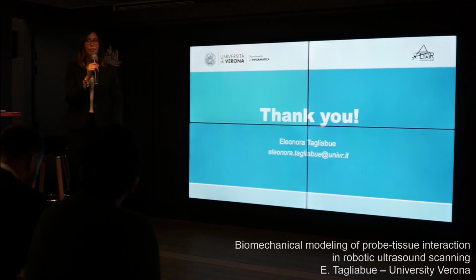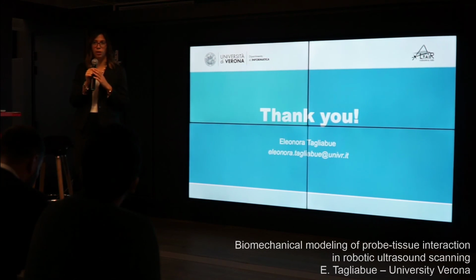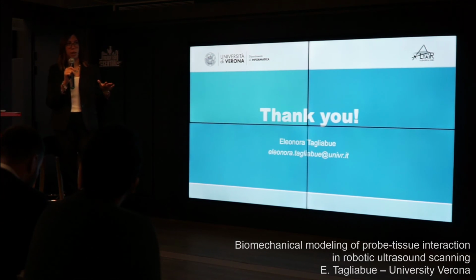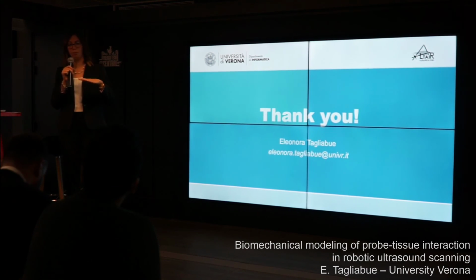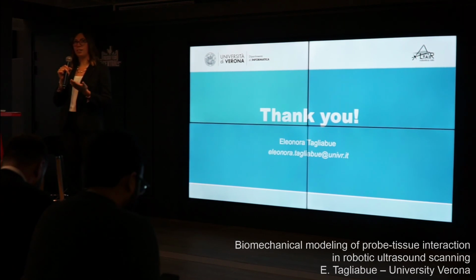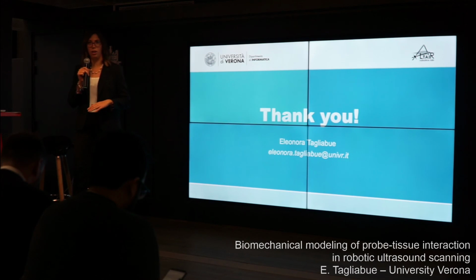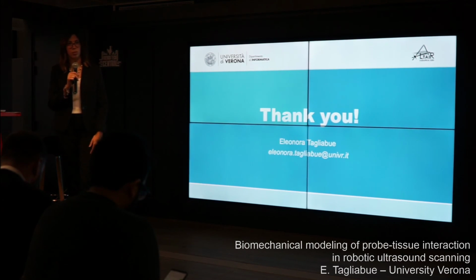Yeah, so unfortunately I had no time to dig into detail of everything. But these were results of our previous work where we were using the same breast phantom and performing these experiments of passing from a prone to supine configuration. So we were trying to estimate the elastic modulus of the breast by simulating the change of position of the patient and validating the model against also standing position. Empirically, or was there some optimization loop for that, or some filtering for that? Yeah, there was an optimization loop for that. Yes. Okay, cool.